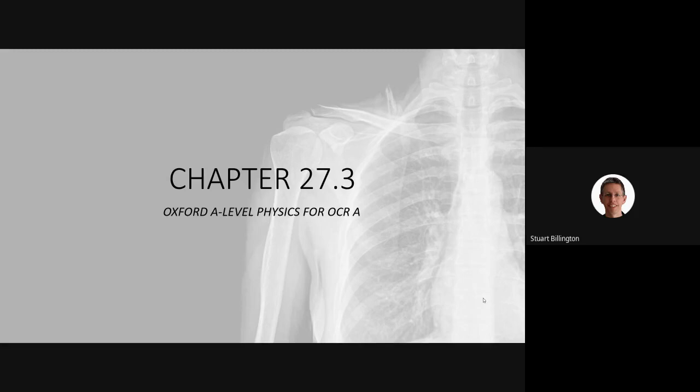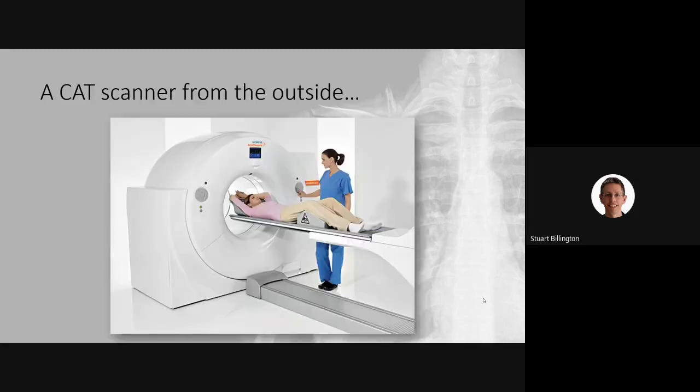Okay, so if you've never seen one, that's what a CT scanner looks like, or a CAT scanner. It's not quite the huge machine that an MRI machine is, if you've seen one of those. It's also a donut. The 2 machines have that in common, and the patient goes through the hole in the middle, but the CT scanners are a lot more compact.